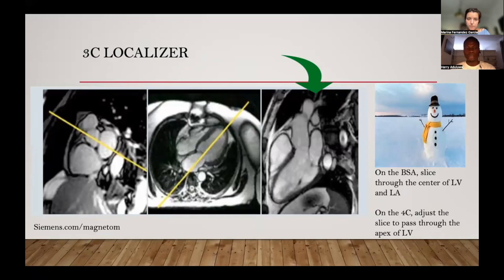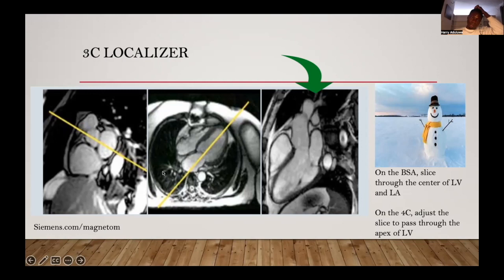Okay, you want me to explain it a little bit again? Yes. Okay, good. So the snowball is the one that has the yellow line through it. That's exactly where you see this is snowball. This is first edge here. Second edge here. Then you run perpendicularly your scan line through it. So when you run perpendicularly your scan line through it, you should also learn to reposition your line on the four chamber to make it perpendicular on this also, and then you get this. So why I brought out this one is just to show that this year, it looks like this, and we're good. You understand? Thank you.